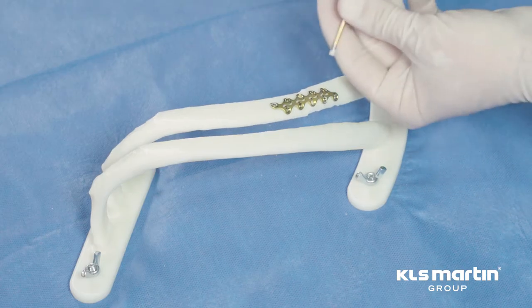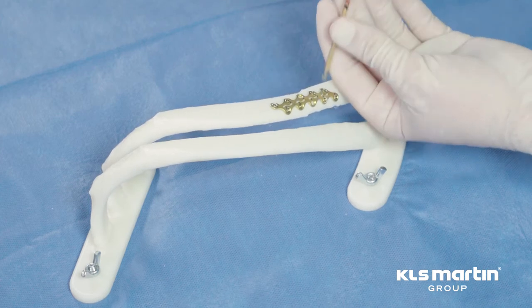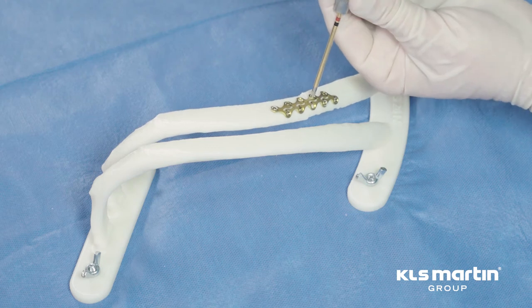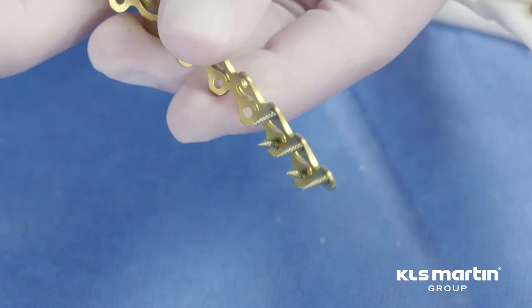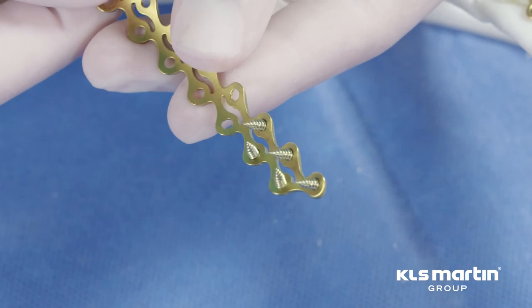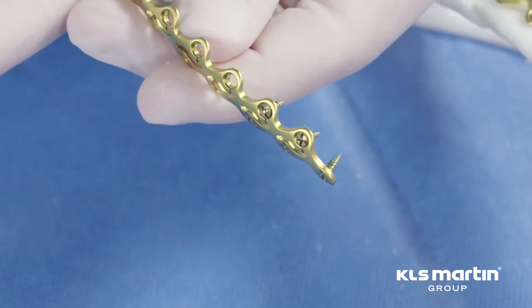That is the final construct. The plates are flexible but sturdy and they allow for an optimal amount of micro motion at the fracture line to ensure optimal healing. With this close-up view of the screw-plate configuration, one can see the converging nature of the screws. This is designed to minimize the risk of screw pull-out.